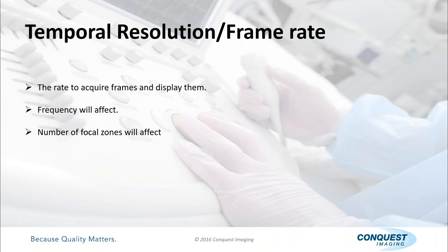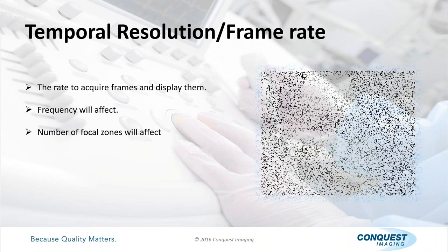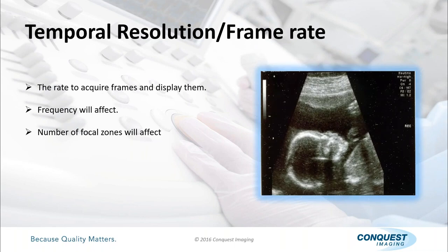Temporal resolution, I talk about the frame rate. It's basically how fast the image area itself, only the image area, gets refreshed. It's normally in these set of numbers, which I know you can't read, but they're up there.